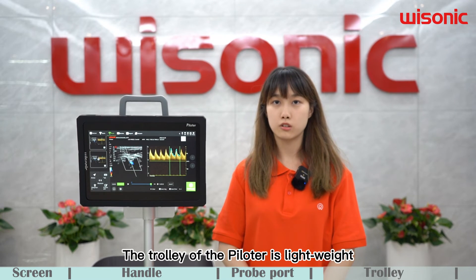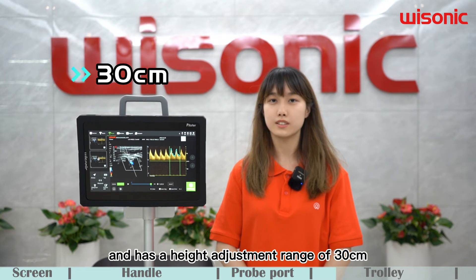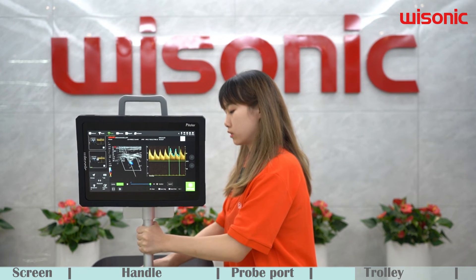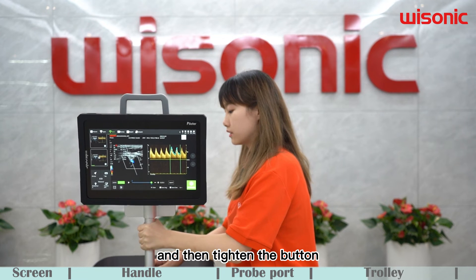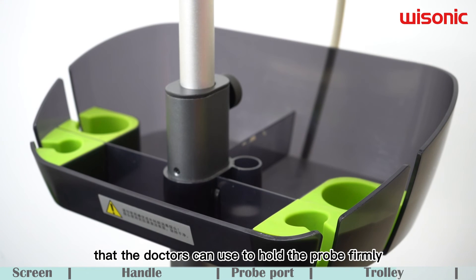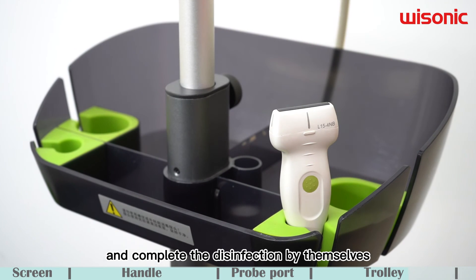The trolley of the Piloter is lightweight and has a height adjustment range of 30 cm. To change the height, you can loosen the back knob, move it up or down, and then tighten it. On both sides of the trolley, there are disinfection probe holders that doctors can use to hold the probe firmly and complete the disinfection by themselves.